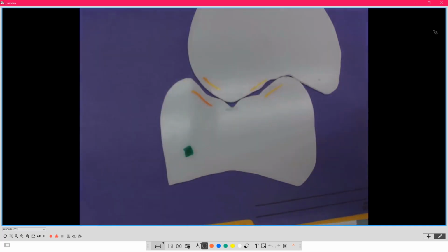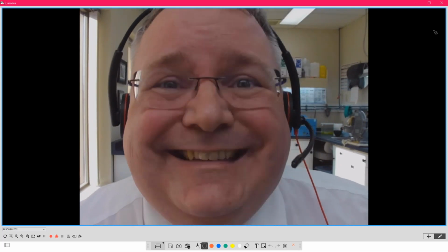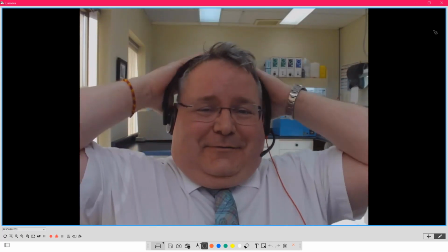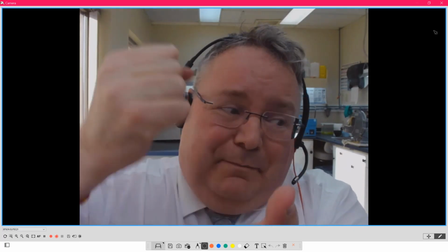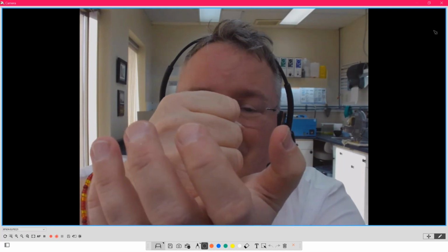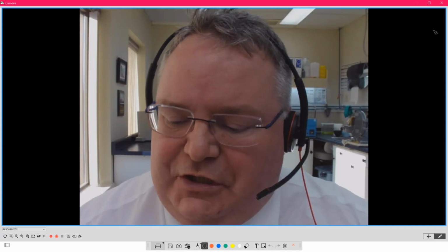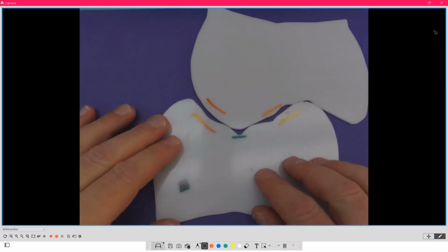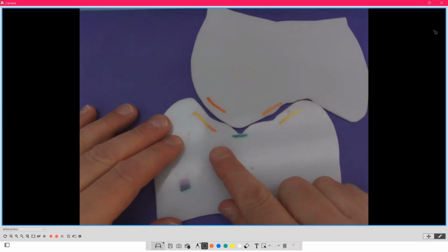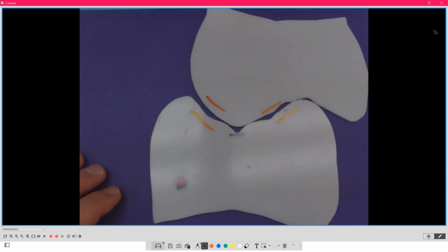It's mincing. So for all of you out there that are wet finger, bear with me, that have worked in it, how many times has a patient come and said, I can't eat lettuce, can't chew lettuce? And it was like, because you can't break the fibers of lettuce when you mill. But when you have a mortar and pestle and you're hammering it, like lingual form and physiodens and now MFT do, you're crushing it. These are crushing teeth. And now that works far better in function. So now it comes up and it's crushed by the upper opposing cusp inside the fossa like a mortar and pestle. And the teeth are far more effective that way and far more efficient.